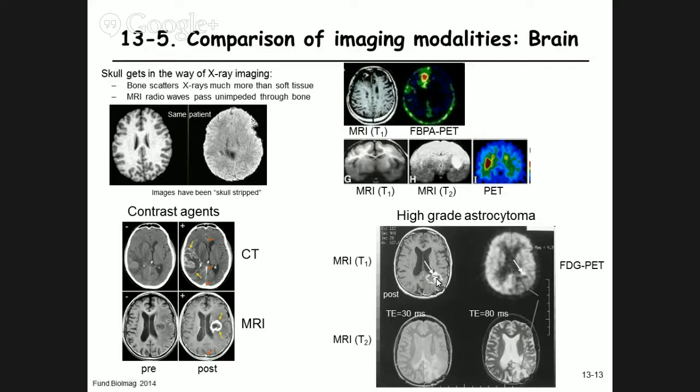Now, where would one want to do the radiotherapy? One would certainly not want to do the radiotherapy where there's necrosis, because necrosis by definition is already dead cells. So one will want to hit the tissue where the cancer cells are most active, and that would be here, most likely. Depends a bit on the tumor type, but that's where one would want to attack, even though by all the other techniques, the largest part of the lesion is somewhere else.